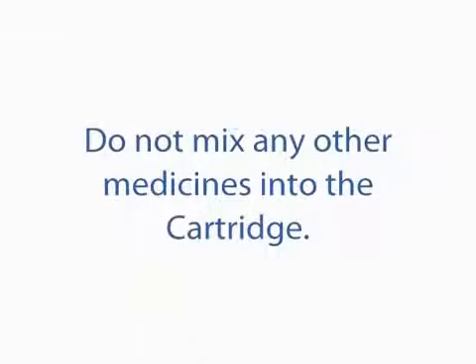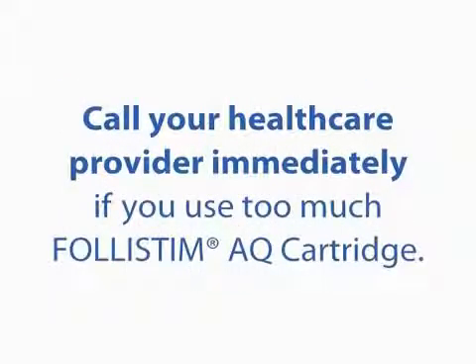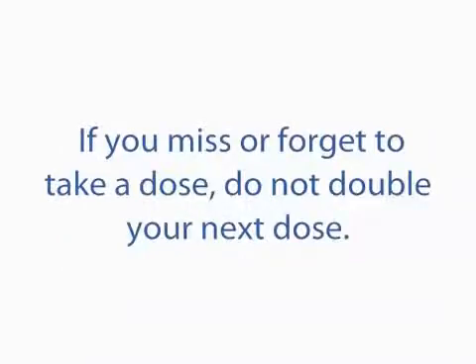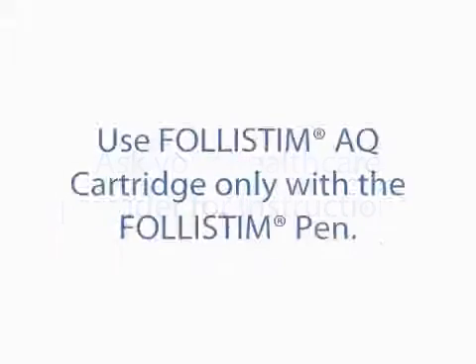Do not mix any other medicines into the cartridge. Do not change your dose of Follistim AQ Cartridge unless your healthcare provider tells you to. Call your healthcare provider immediately if you use too much Follistim AQ Cartridge. If you miss or forget to take a dose, do not double your next dose. Ask your healthcare provider for instructions. Use Follistim AQ Cartridge only with the Follistim pen.